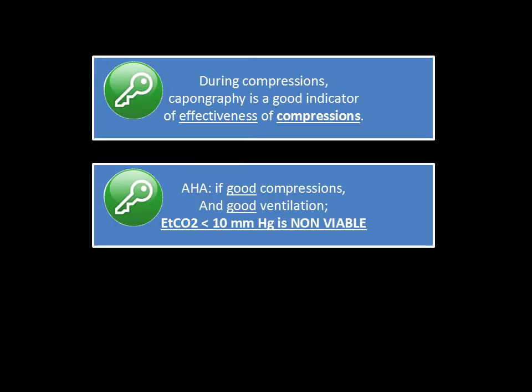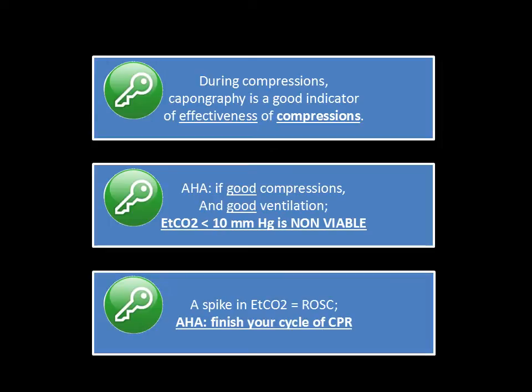That is a non-viable patient because you're moving blood around, you're ventilating correctly. They just have no metabolism. So even though you have good perfusion, good compressions, that's a non-viable patient. A spike in CO2 is ROSC, and I would finish your cycle of CPR.